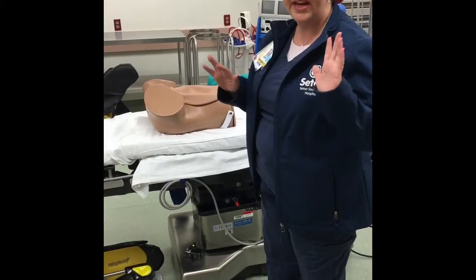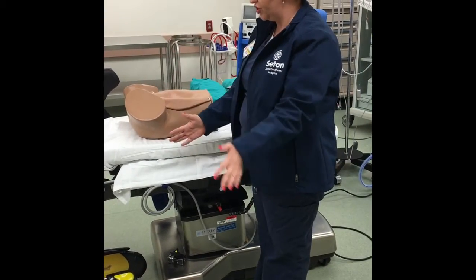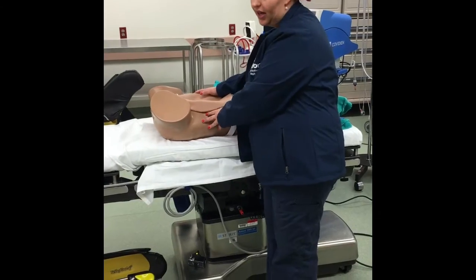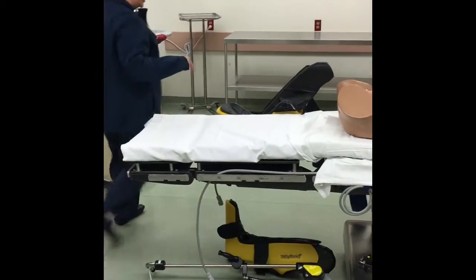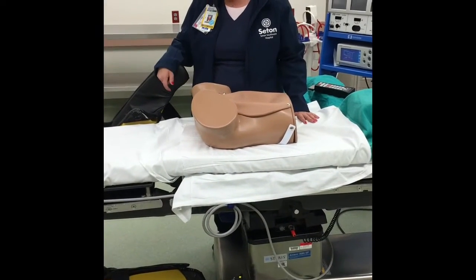So now we are going to assume that we've already brought the patient in on the stretcher, and the stretcher came in here, and the patient's gonna move themselves over to this part of the bed. While they're moving, the stretcher is going to be here, and you're actually going to be on this side of the bed to ensure that the patient does not fall.